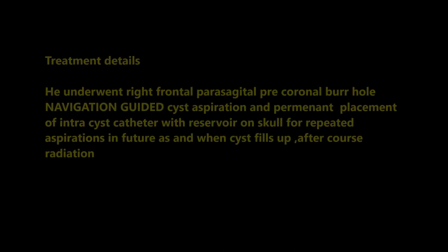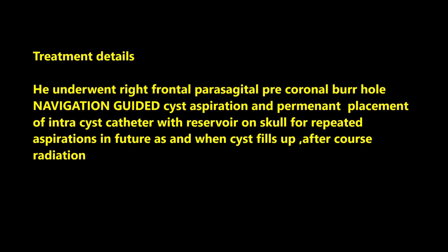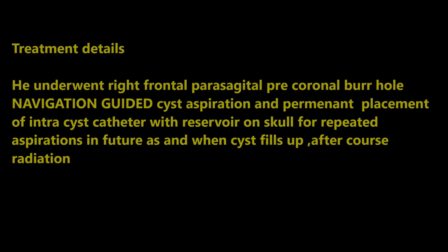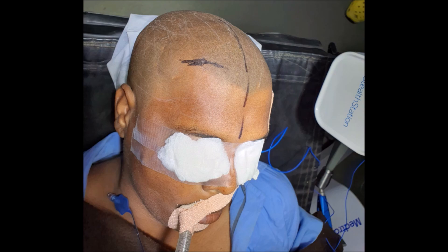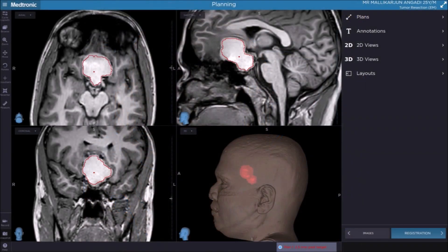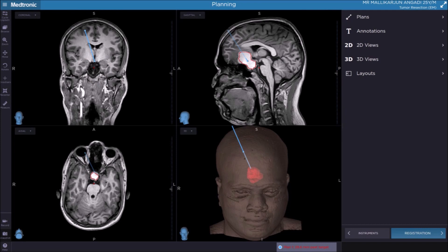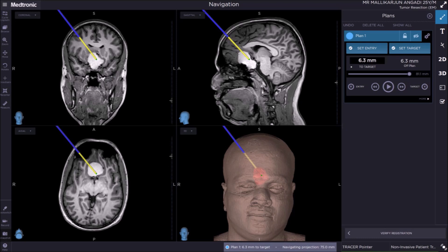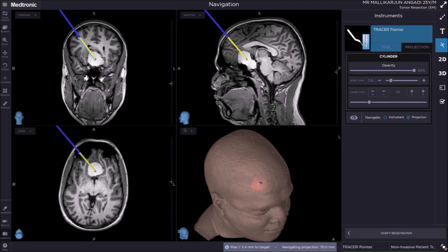He was taken up for surgery. He underwent right frontal parasagittal pre-coronal burr hole and navigation-guided cyst aspiration and permanent placement of the catheter inside the cyst with reservoir and radiation. The entry point was planned on the right side because the cyst was extending onto the right side subfrontally and paramedian.